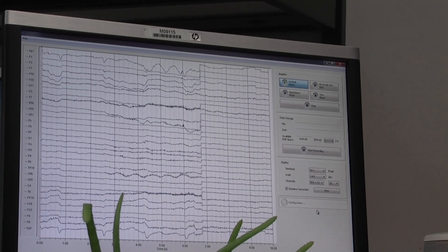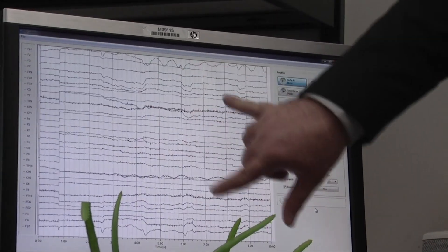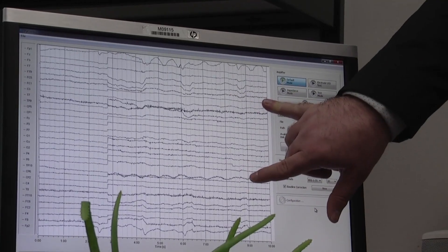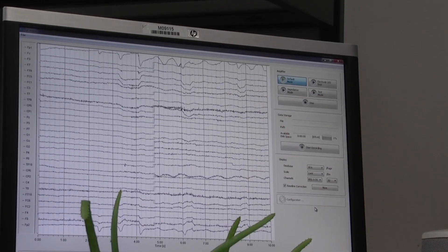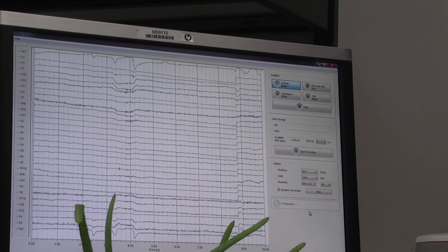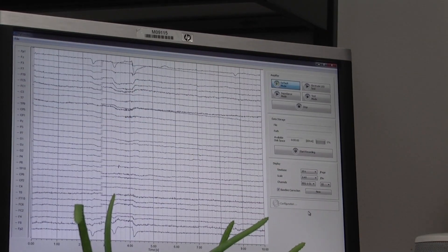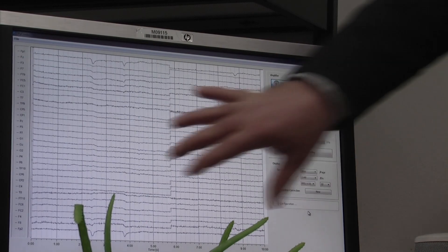So what we see in a good system is not a ton of issue, but what you see are a lot of random movements happening throughout the entire EEG signal. And those aren't actually caused by the brain. That's not your brain telling your muscles to move. That's actual artifact, that secondary stuff that comes in to try to talk about what exactly is going on in the brain.